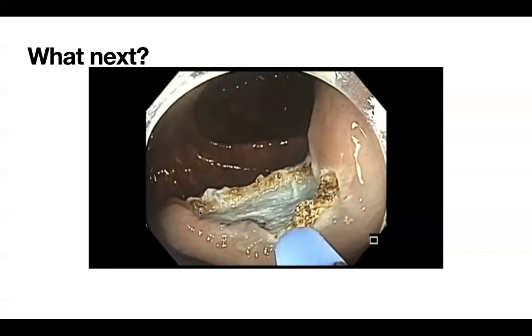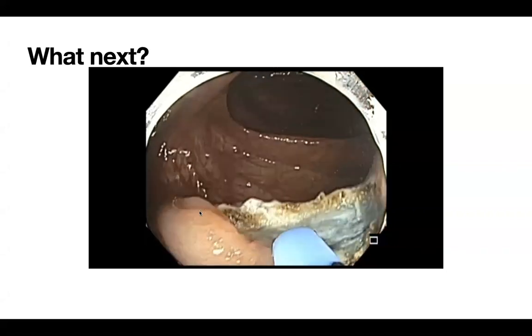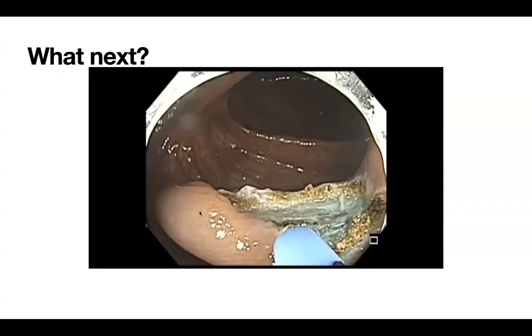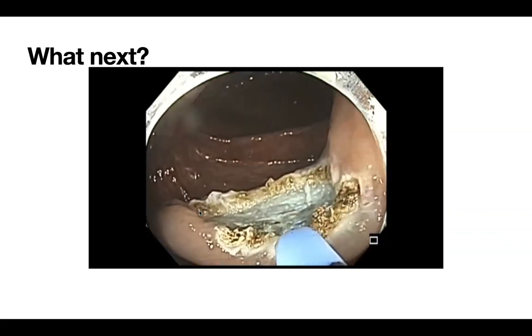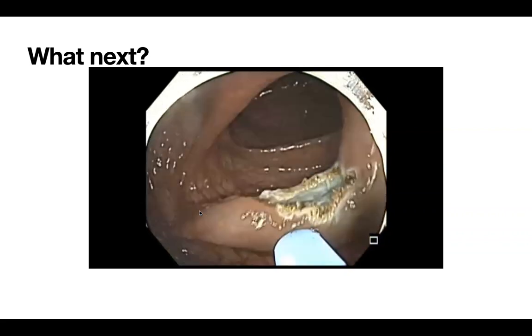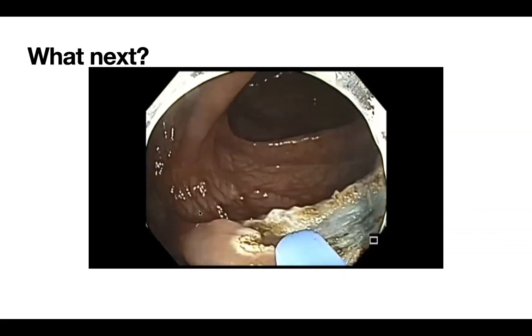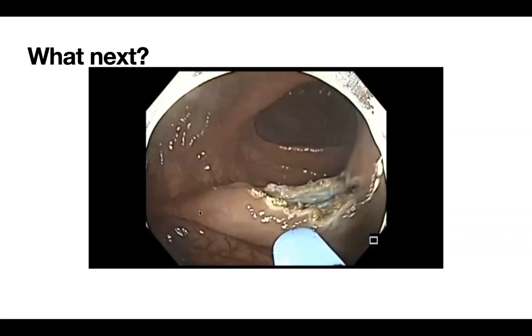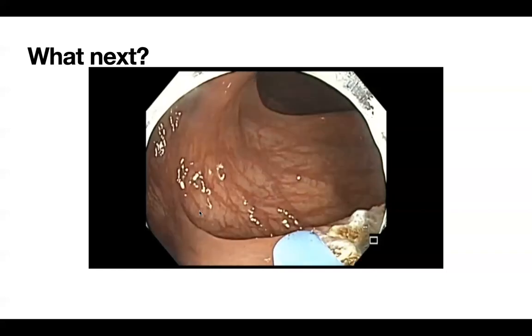But at the same time, you have to keep in mind, although you see superficial submucosa, the current damage could go deep. And you may be fooled by looking at a superficial submucosa, thinking that the damage is limited to that area, if you have closed the snare very slowly and had a long duration of current application. So something to keep in mind, right? At the end of the day, the depth of injury depends upon the total amount of energy that is delivered.